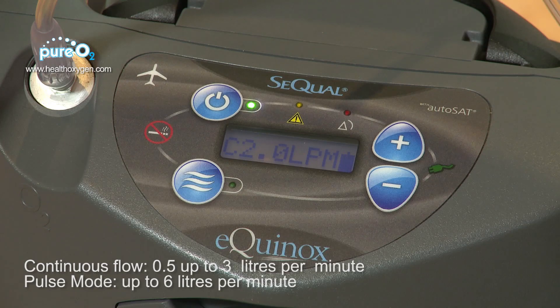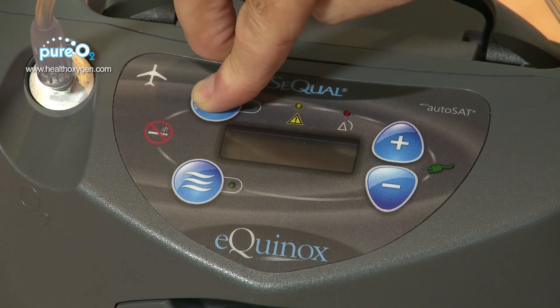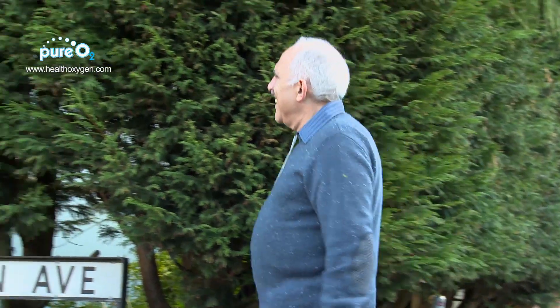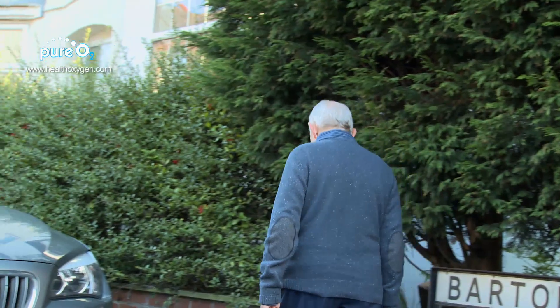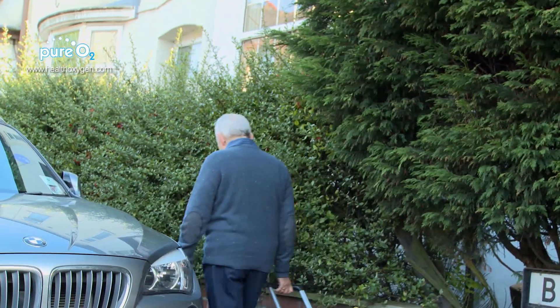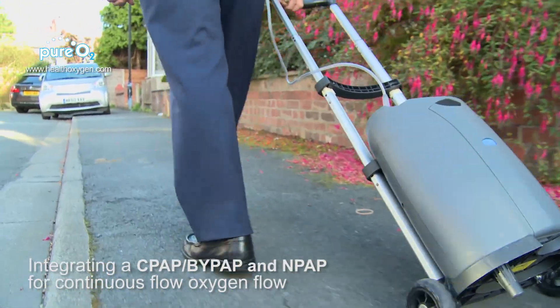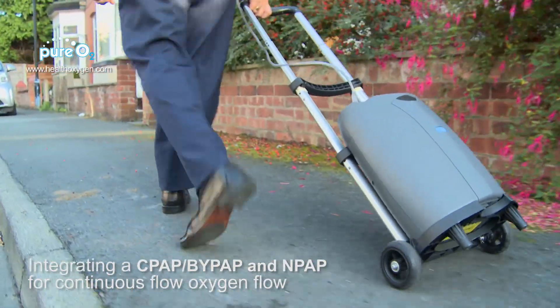In pulse mode, this model has the added safety feature of going into continuous flow mode if it detects the patient is not taking a breath, and it will remain in this mode until a breath is detected. This unit allows oxygen-dependent patients the freedom to leave home for exercise, walks, and visits to friends and family.